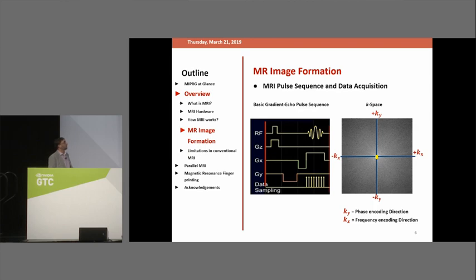The localization of the signals is very important in MRI because you need to repeatedly apply three different gradient fields, labeled as GZ, GX, GY in this diagram. Then the RF pulse originates, which takes the signal to a particular location in the K space, and then the A to D sampling is applied, and we get one line of K space. The process needs to be repeated, and we apply a different phase encode gradient, and then the second line is acquired. So we need to apply a series of RF pulses, and as a result, the whole of the K space needs to be filled.